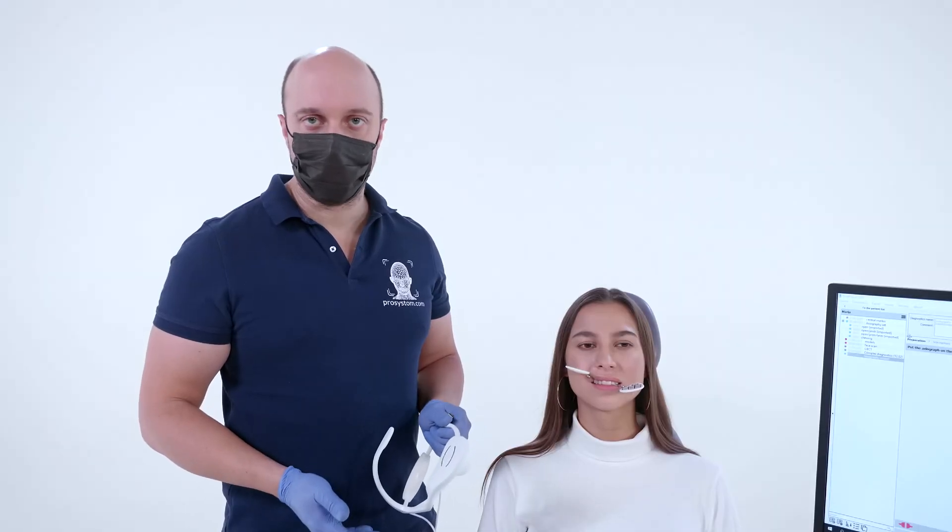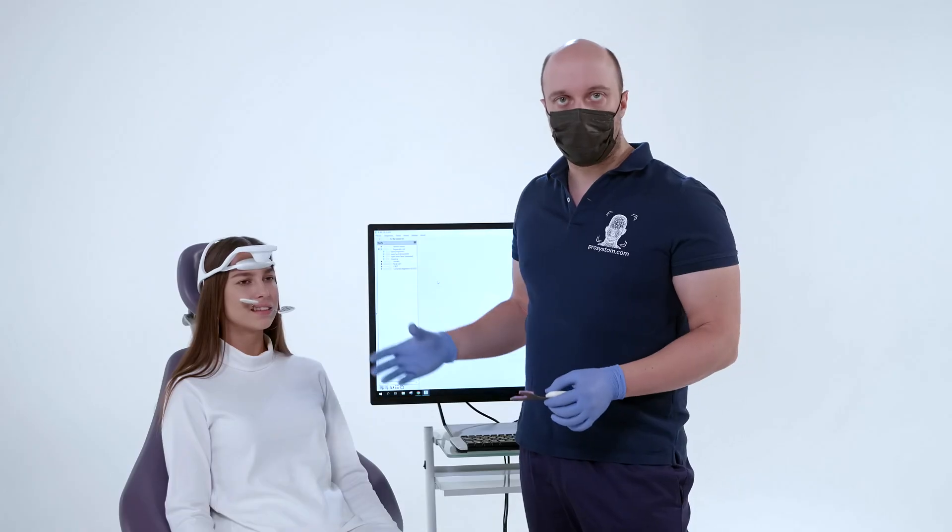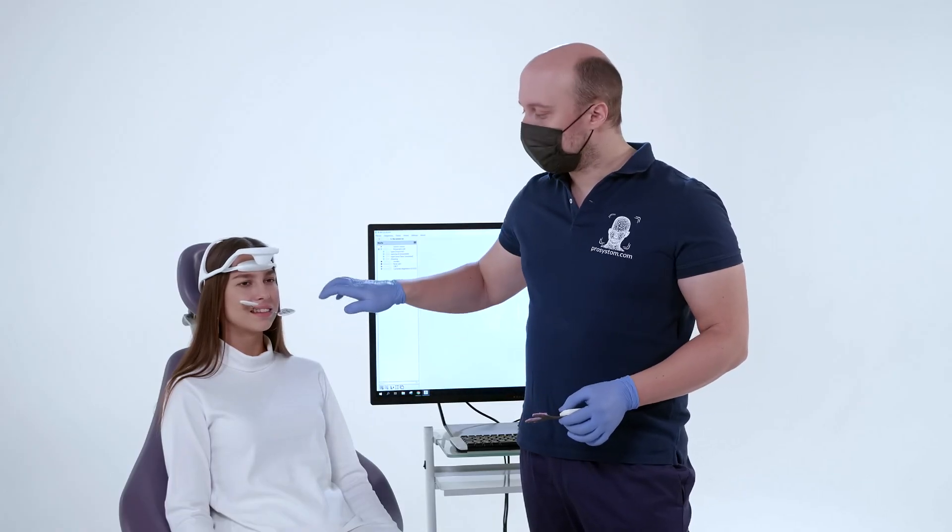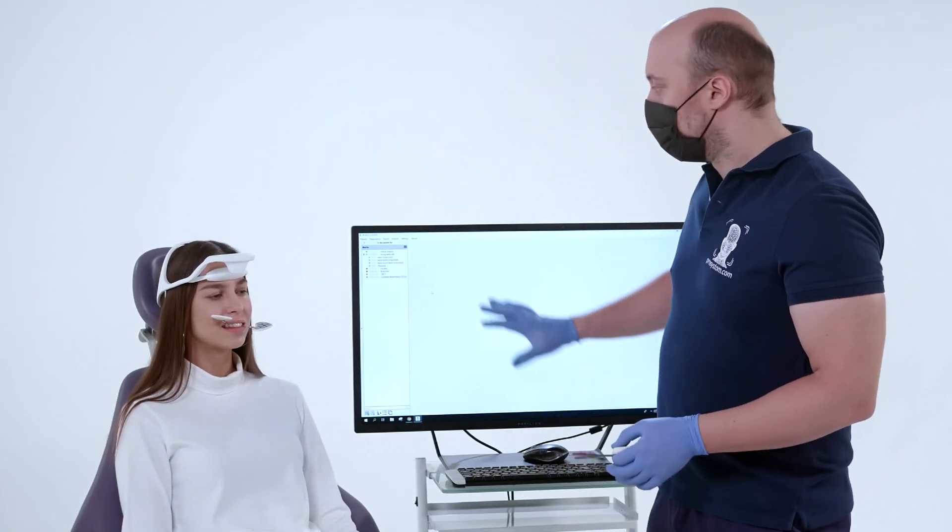We start Axiography. The device is connected. We check how the markers are fixed. The markers should be approximately horizontal. We connect the Axiograph to the USB port.